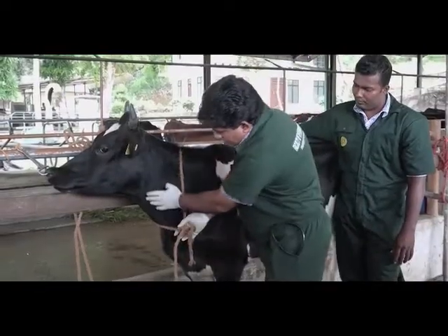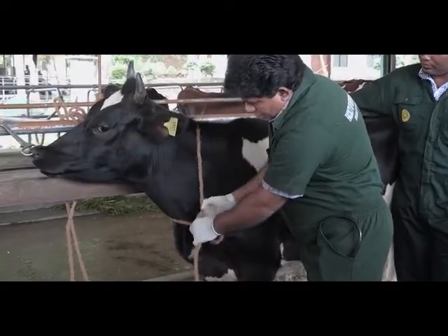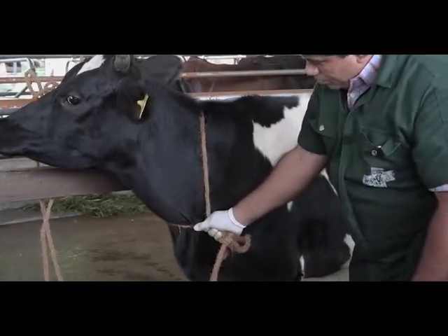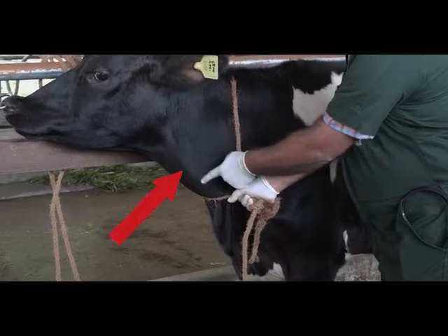Move the neck belt formed by the rope towards the thoracic inlet and firmly grab it to compress the ventral neck region as demonstrated. Now you can see the bulging of the jugular vein.